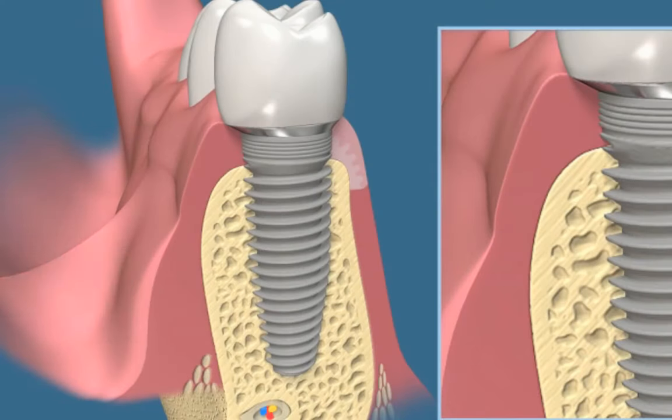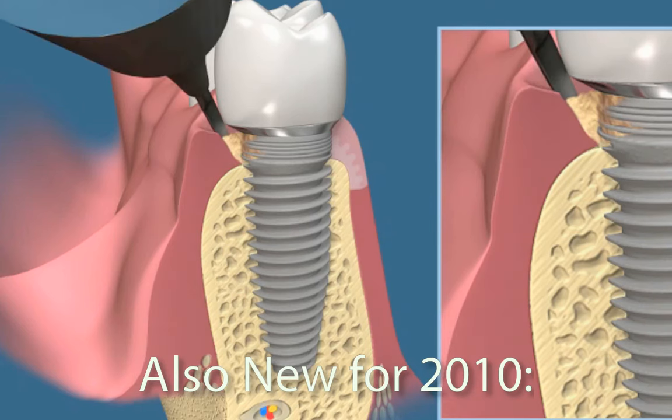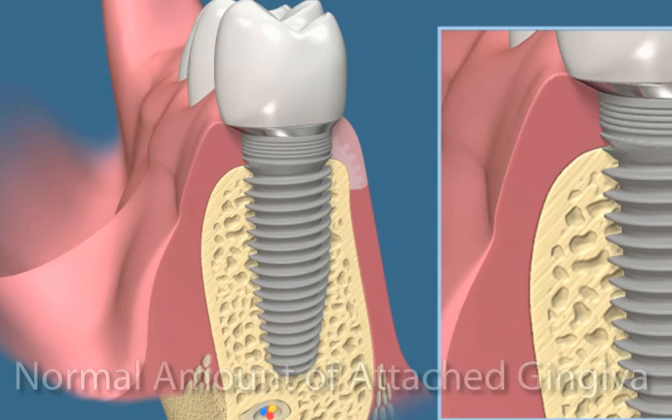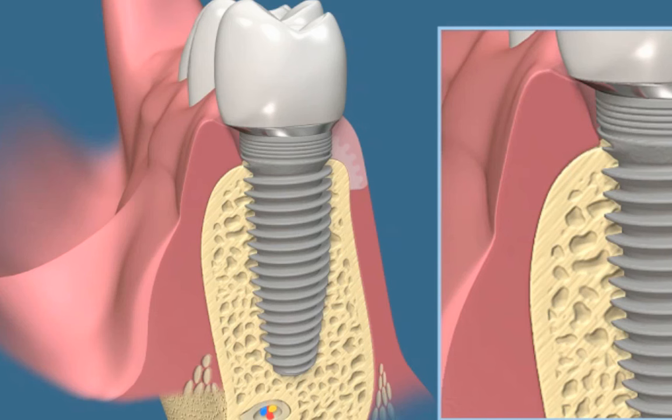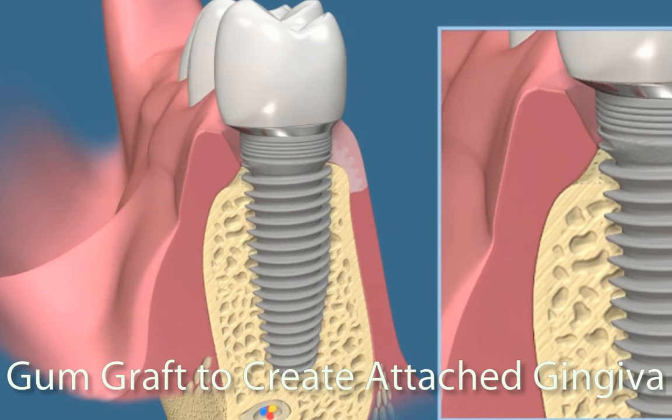When the food hits the gum in this area, it can have no effect, or it can break the seal between the gums and the implant head. This newly created pocket quickly fills with plaque and tartar. In the early stages, it can be cleaned, and the gum tissue may reattach to the implant. This attachment can be broken again, however, creating a deeper pocket that cannot be adequately cleaned and resulting in the tissue being unable to reattach to the implant.